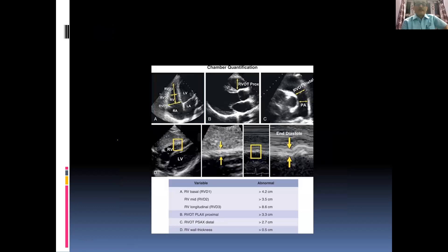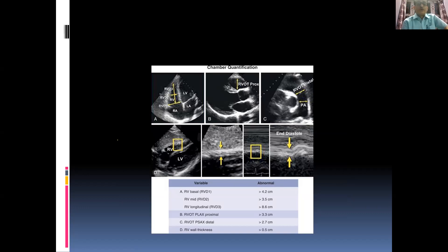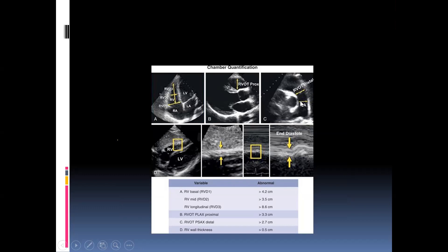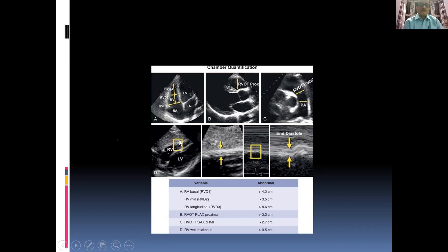In diastole, measure the right ventricular diameter at the base — RVD1 — just above the level of the tricuspid valve in the dilated basal portion of the RV; then the mid-cavity — RVD2; and finally RVD3, the long axis from the midpoint of the line joining the two tricuspid annuli to the apex of the RV. RV wall thickness is measured from the subcostal four-chamber view at the level of the tips of the open tricuspid valve leaflets.